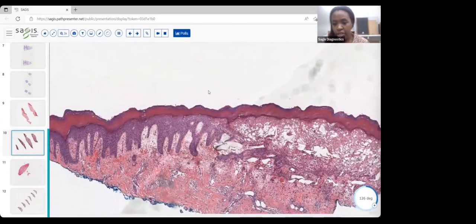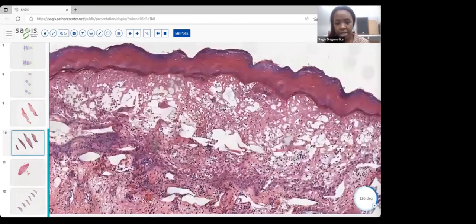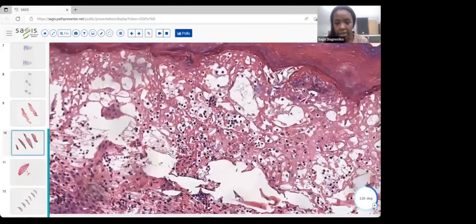So this balloon degeneration where we have vesiculation that is just so scattered and irregular. It's really from edema. We know that this is kind of the pattern of vesiculation we see when it's derived from edema. And this is intercellular edema, and we can also see that inside the cells that there is edema as well.